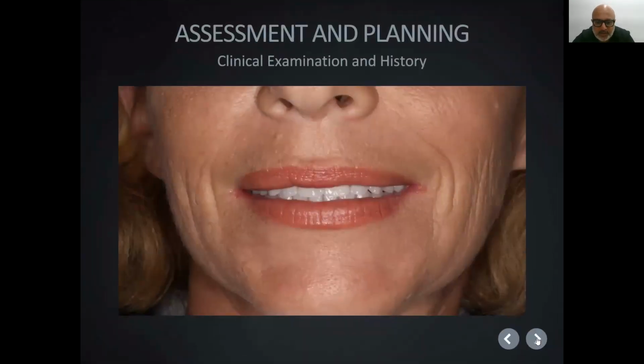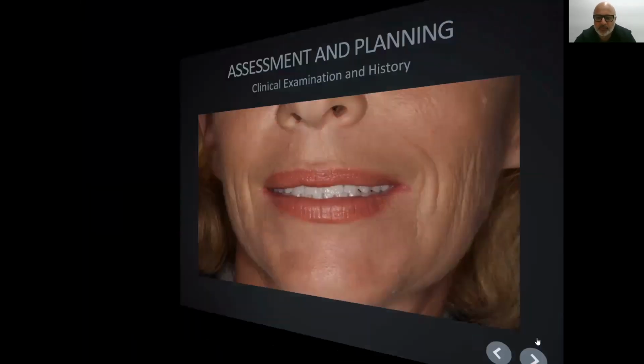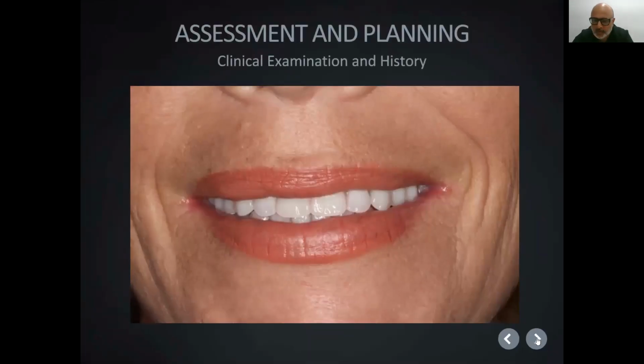She's still, as you can see in this picture, I think this one was probably about a couple of weeks post-surgery. So she still has her provisionals in, and there's still evidence of angular cheilitis at the corners of her mouth, sores from the lack of vertical dimension from her dentures, which she originally had. And that was a close-up from there.